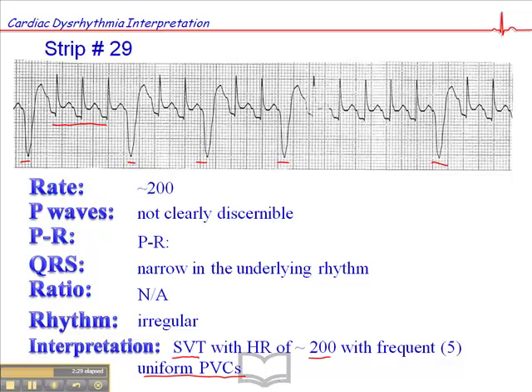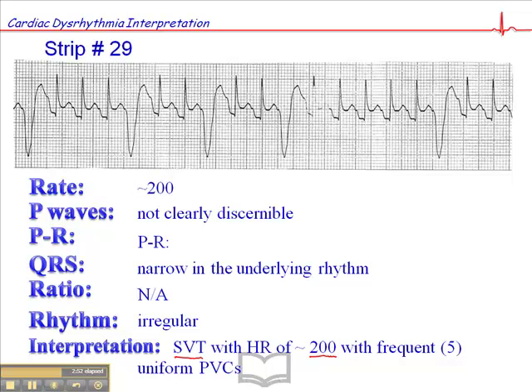With a rhythm like this, you might ask yourself: do I treat these premature ventricular complexes? And the answer is no. You would treat the SVT — you want to know why the patient is in an SVT with a heart rate of 200, and you want to disrupt that SVT. You would disrupt the SVT with either vagal maneuvers, pharmacologically, or with cardioversion, depending on the hemodynamic status of the patient. I'll discuss this further in a separate ALS presentation.